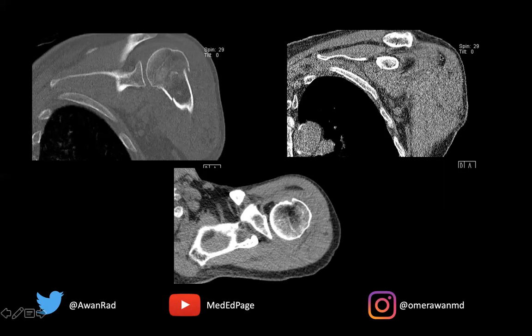But the other finding here is a fat-fluid level in the subacromial subdeltoid bursa. We can see that here very well. We have a fat-fluid level in the subacromial subdeltoid bursa, suggesting a bursal lipohematoma. That's a marker for a rotator cuff tear — and it must be a full thickness rotator cuff tear, because the only way fat and blood can get from the bone all the way to the subacromial subdeltoid bursa is if there's a full thickness rotator cuff tear.